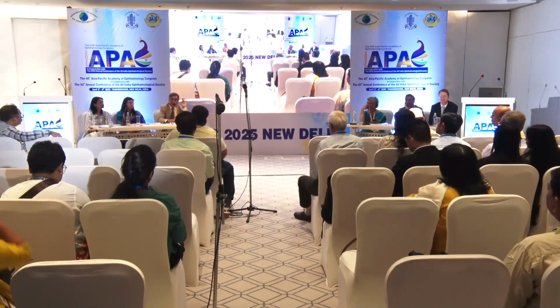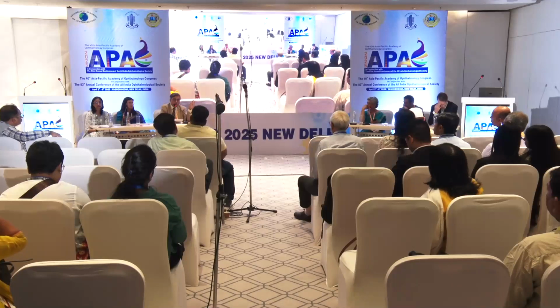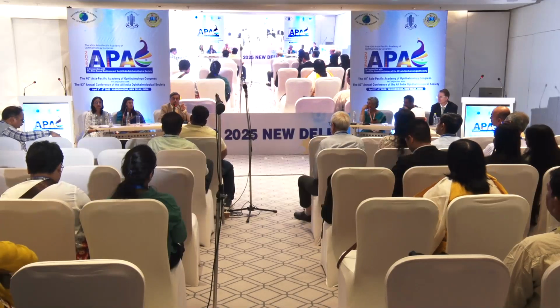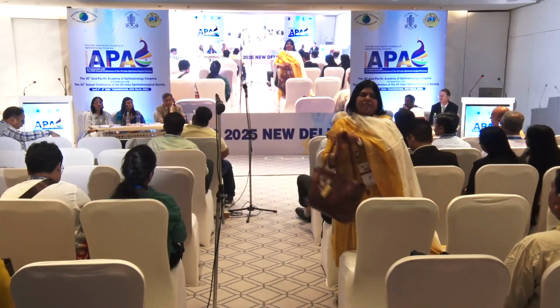Similarly, for OCT angio, there are situations when you start the treatment, you may use the OCT angio and use it for follow-up. But to conclude the treatment, it is not based on OCT angio, because as he showed also, some vessels will remain. It can be used to pick up an early recurrence, but it cannot be used to stop treatment. This is the other important thing.